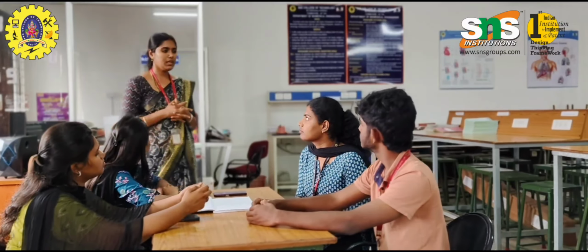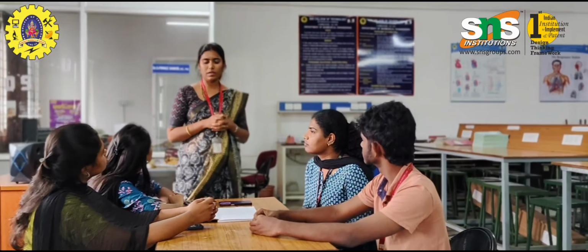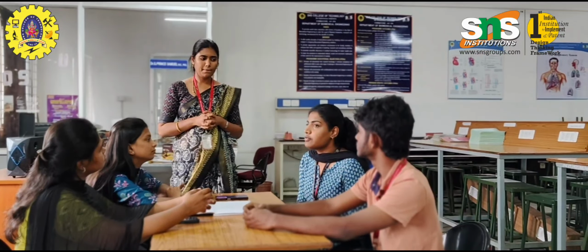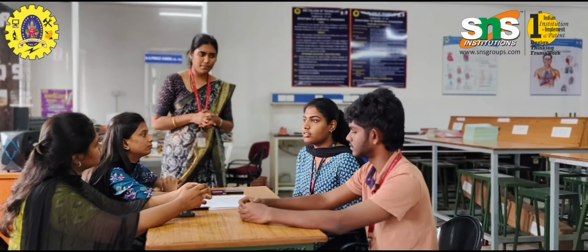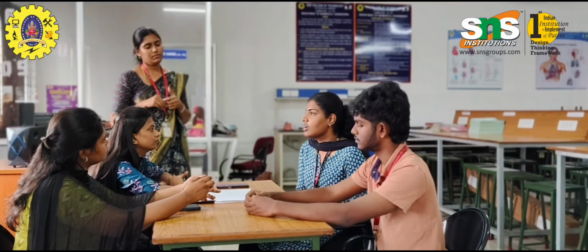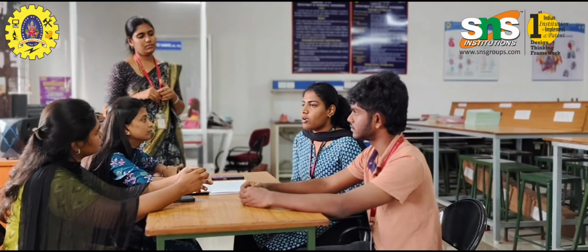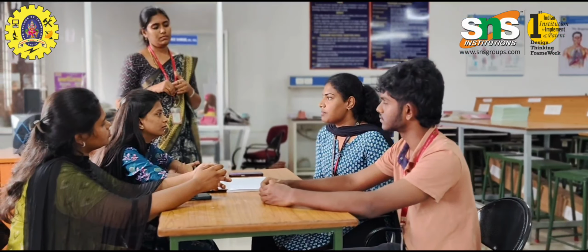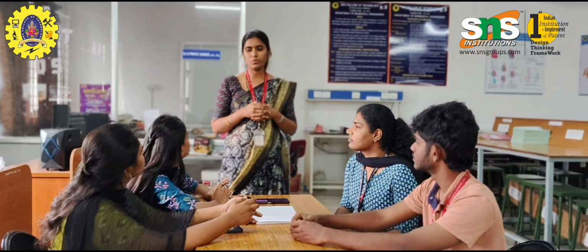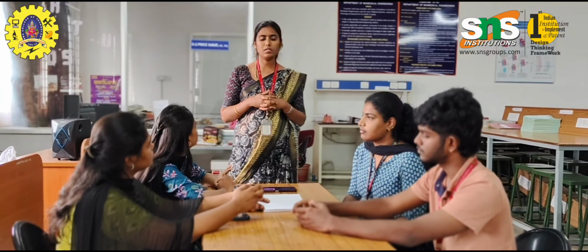What is the frequency range which is being used for cutting and coagulation, especially in an ESU machine? A high frequency range of 300 to 500 kilohertz is used. A high frequency is used because low frequencies may stimulate the nerves and muscles, and it may cause pain. It's a very good explanation of why we are using high frequency current in an ESU unit.